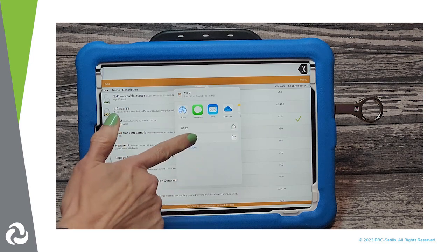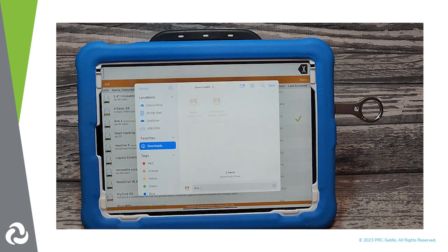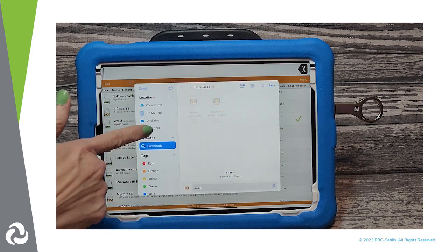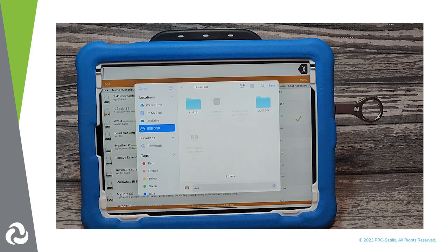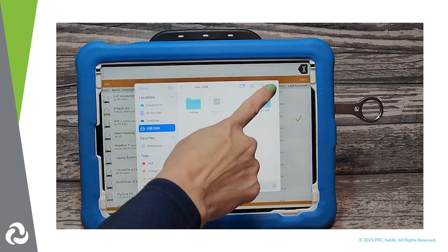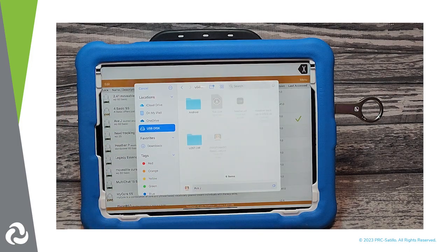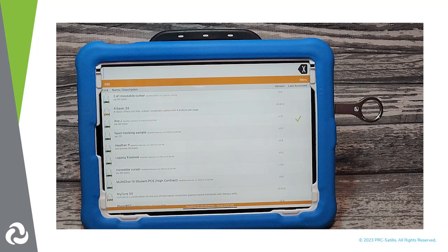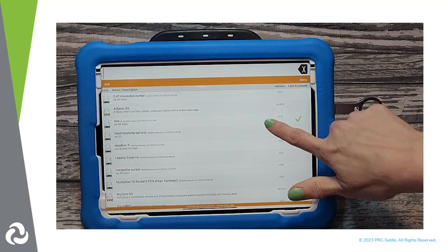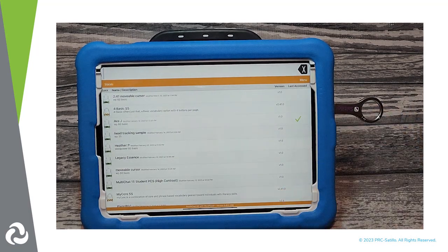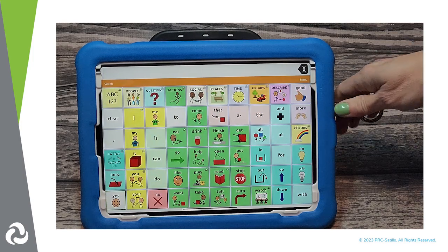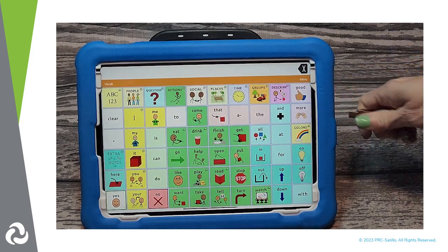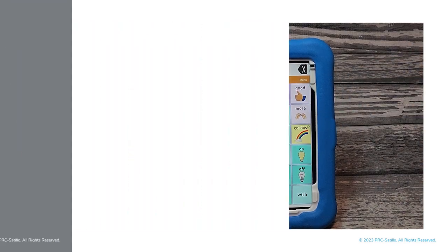Select Save to Files, then tap on USB Disk. Tap on Save in the upper right corner of the popup. Your vocab file is now saved on the dual USB. You can go back to your customized vocabulary file and safely remove the dual USB drive from your Via with TouchChat.